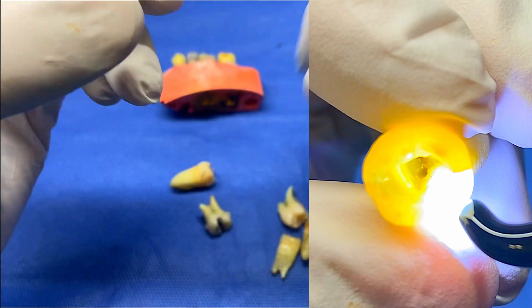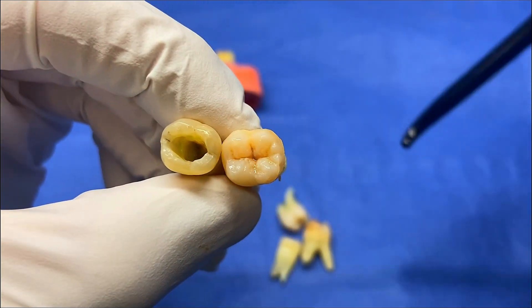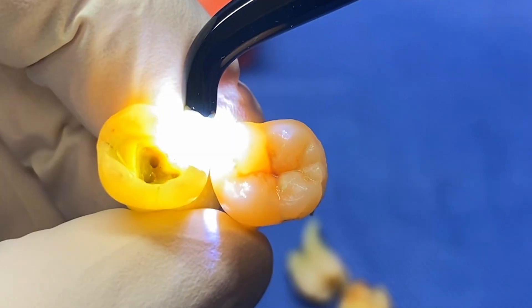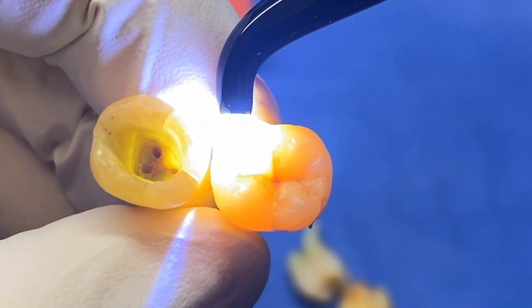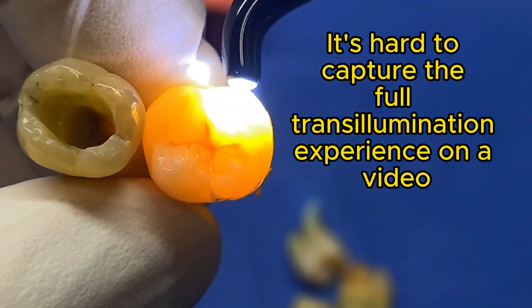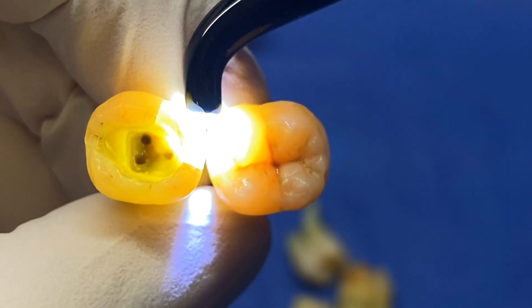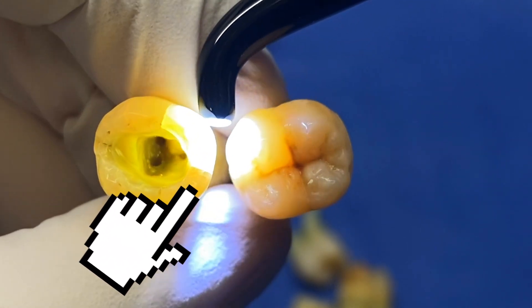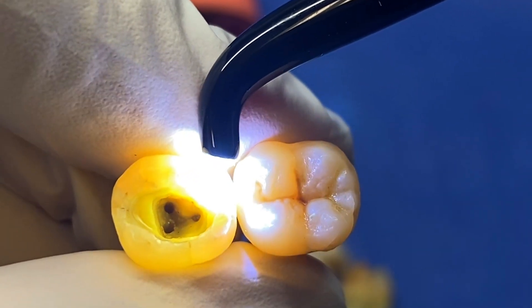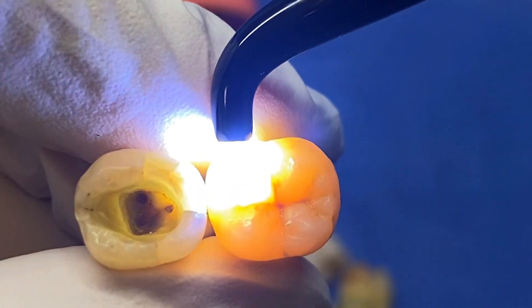You can see how the light just stops right at that crack line. Same with here — it doesn't shine through. Let's do a side-by-side comparison. So we've got right here the stopping of the light on one, and the other one the light just goes right through. That's the difference — one stops the light, so that's the example where the light gets attenuated or stopped at that crack in one tooth, and in the other it just goes right through.